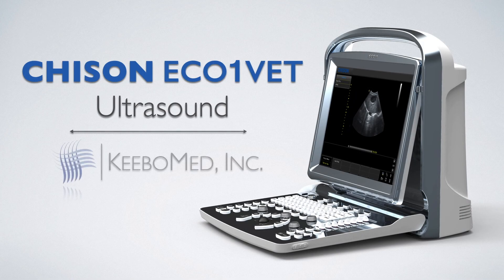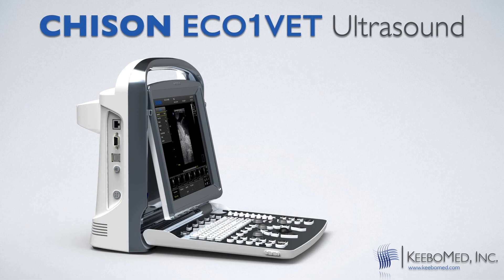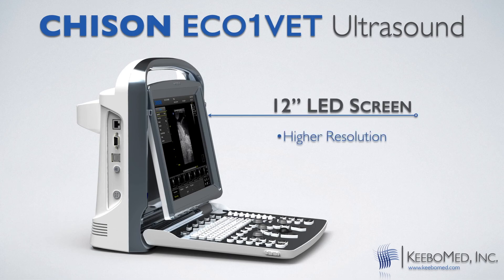The Chisin Eco One Vette is a high value ultrasound for a very reasonable price. The Chisin Eco One Vette has a 12 inch LED screen that is high resolution.